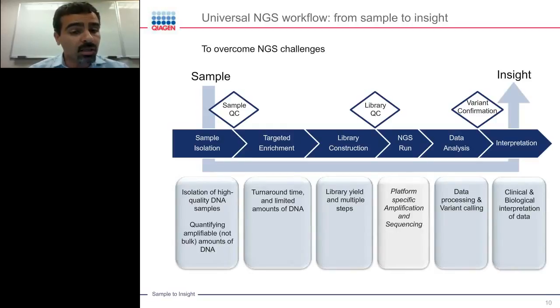The main challenge here is that if you only quantify the bulk amounts of DNA, you might actually be overestimating the amplifiable amounts of DNA in your sample, because some of that DNA might not actually be amplifiable through PCR in this workflow.